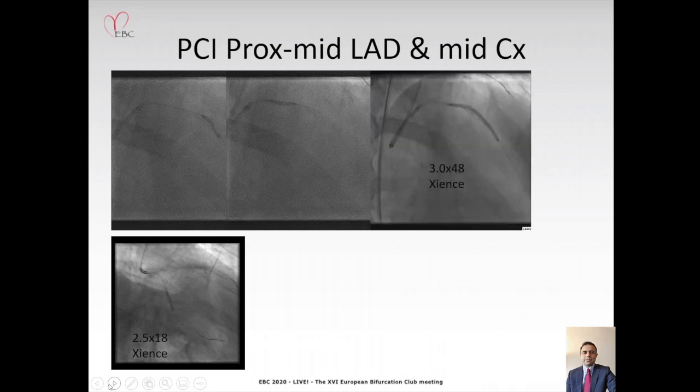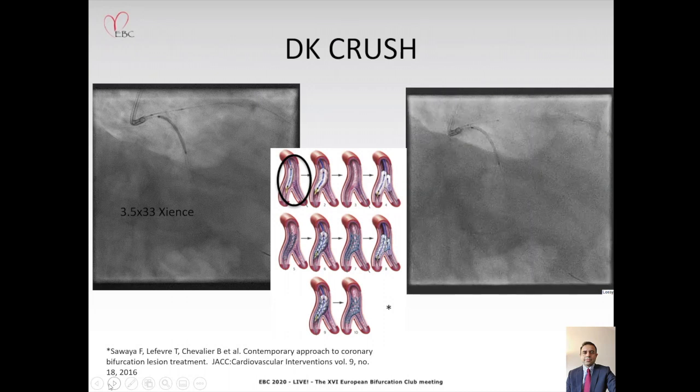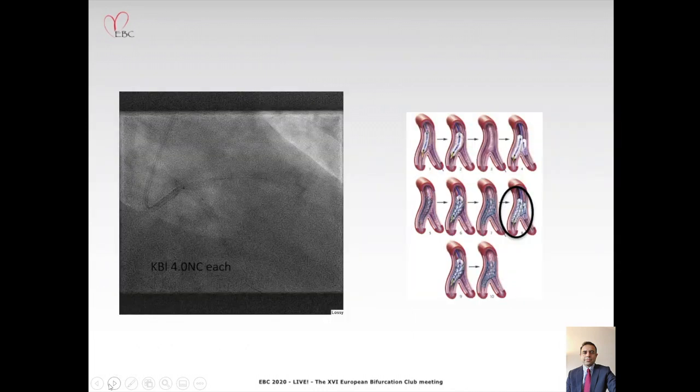So to look at the lesion outline, the vessel outline, study the lesions where they are, and to select the appropriate views that one is going to use, and then to print out those angles and stick them on the screen. That's what we do in our practice, so that we have exactly those same angles that we're going to use when we position the camera, because that's the same angle we'll be doing the IVUS co-registration on.